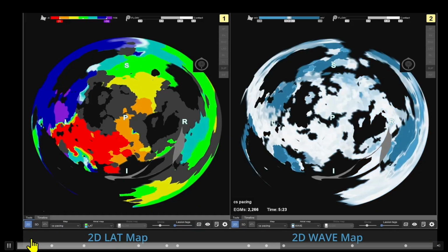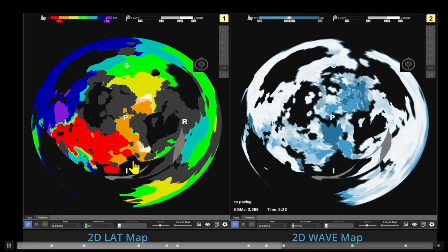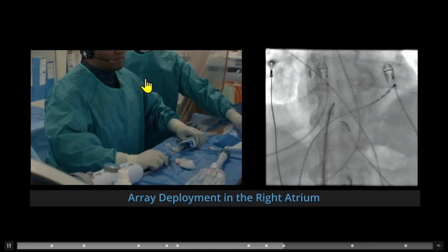Yeah, this is the one. So just to show what this is, opened up at the level of the mitral valve. So this on the outside is the mitral valve, okay? There are veins here, and let me just play this here. And what's happening is you have activation that's percolating here and blocking.